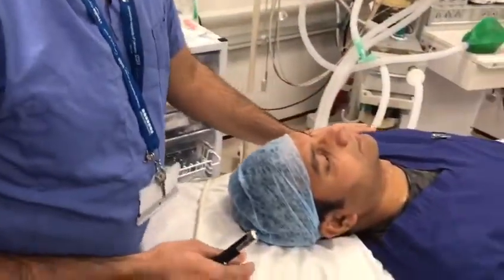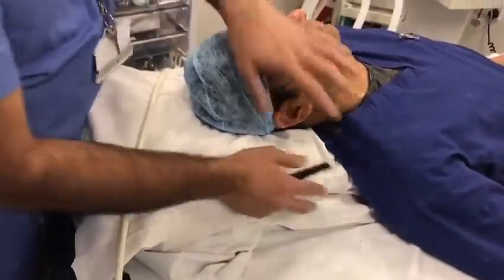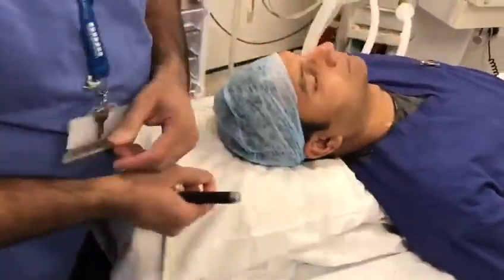In order to perform this block, the position of the patient is very important. As you can see, I have a patient laying supine and I've put the pillows vertically so that I can get much more space to work.